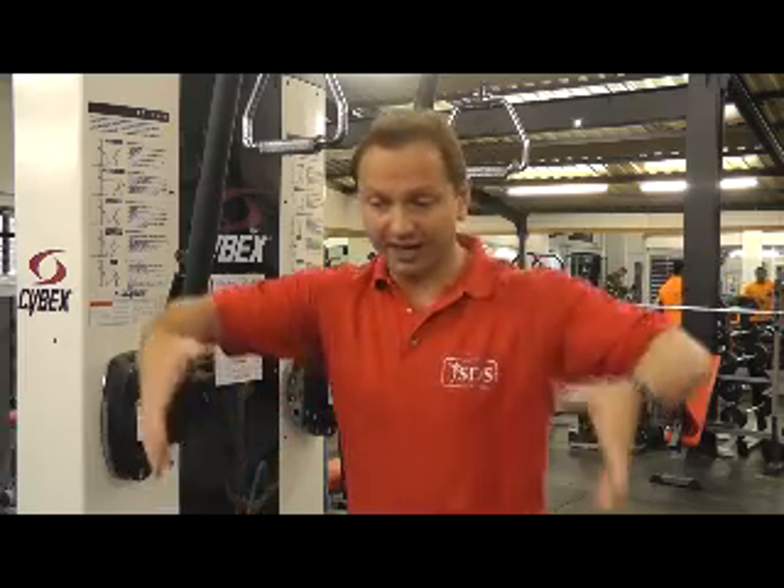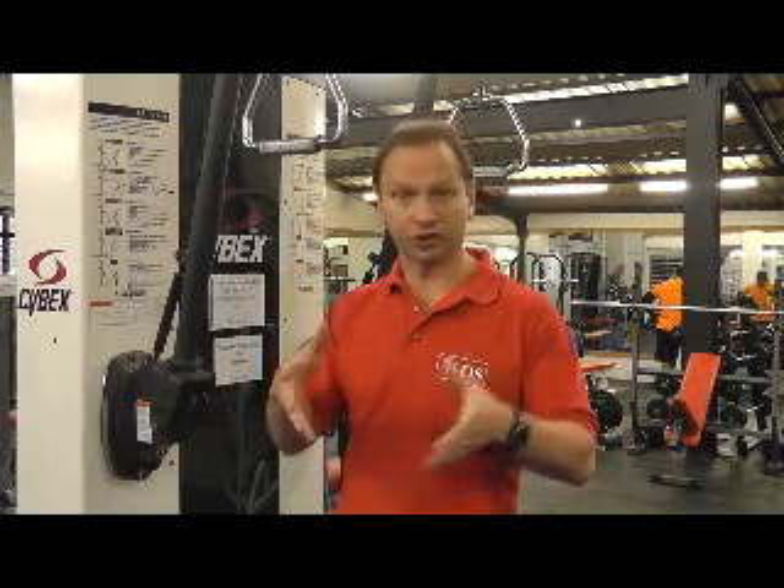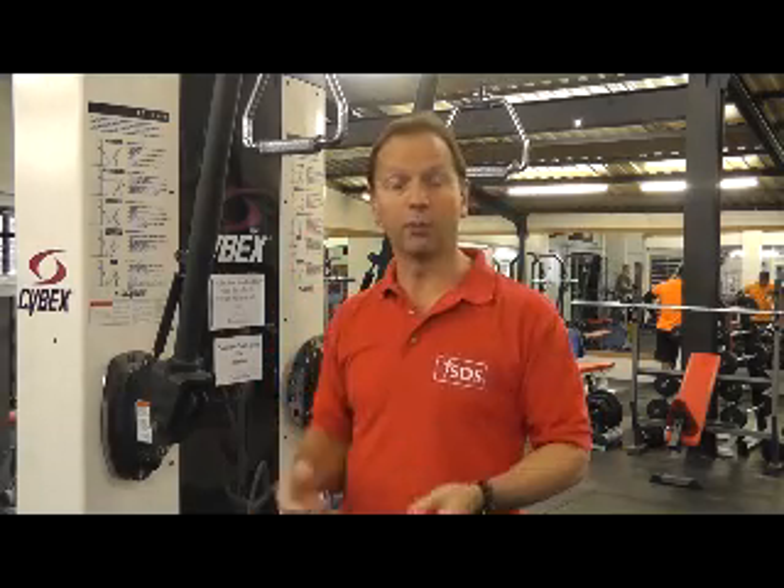When we use the IDD, we're using a high force for 25 minutes. To do that manually would require somebody to physically grab hold of the pelvis and pull with the amount of force we've just seen. This machine will show us what it really feels like to try and do that with your hands.